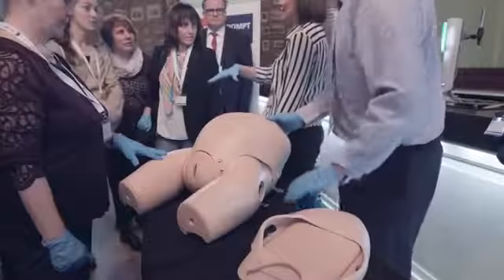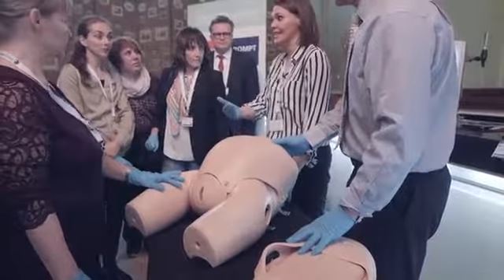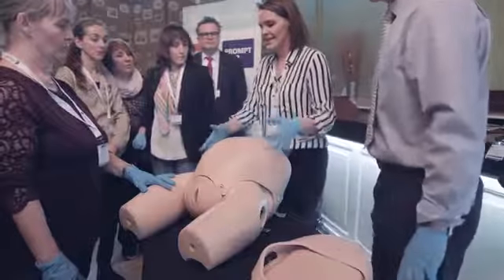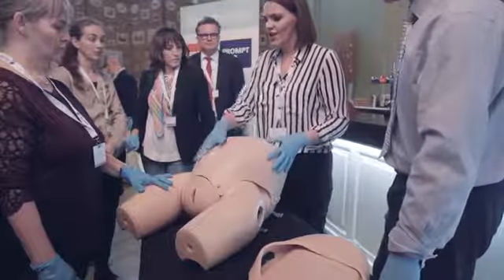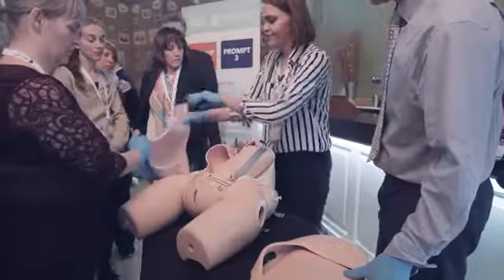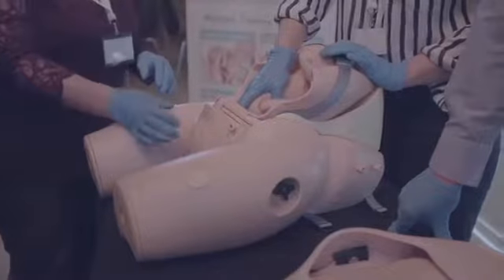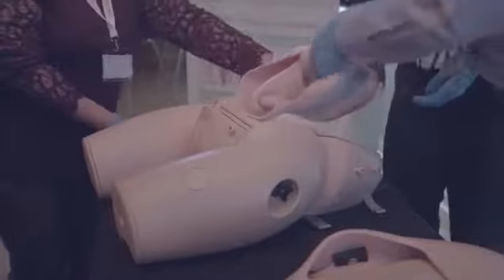So this workshop is just about use of the PROMPT Flex mannequin for demonstrating and learning deeply impacted fetal head during caesarean section. So essentially the mannequin is your standard PROMPT Flex mannequin but with additional modules. It's got the caesarean section skin with a preformed incision, and underneath we've got the baby deep low in the pelvis simulating impacted fetal head, and this strap is used to push baby even lower and tighten it up.